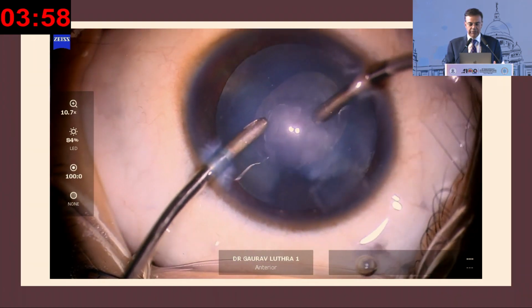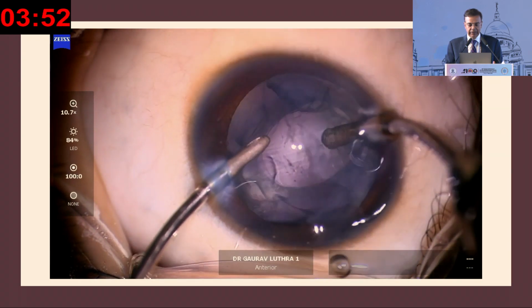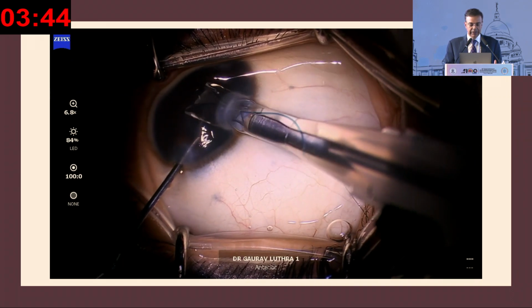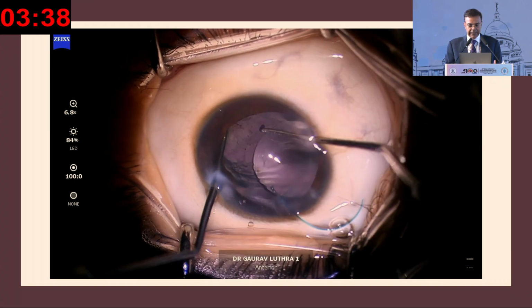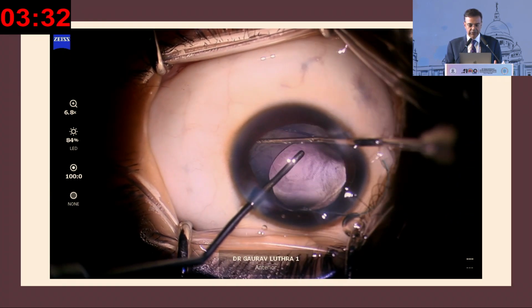But in spite of all my efforts of enlarging the capsulotomy, I feel that we were left with a slightly smaller capsulotomy than what we needed. And I do try to aim for a 4.5 millimeters capsulotomy, because in pediatric cataract sometimes later on the capsulotomy will enlarge a little bit. Now decided to go with a 3-piece lens as I would normally do for such patients, and the white to white was adequate, so I decided that this lens can go into the bag. This child was about 1 year old.